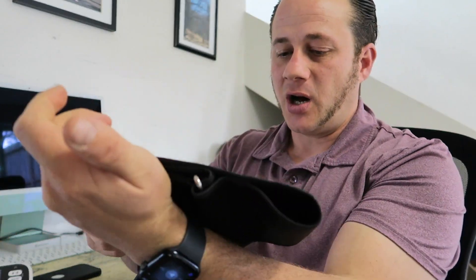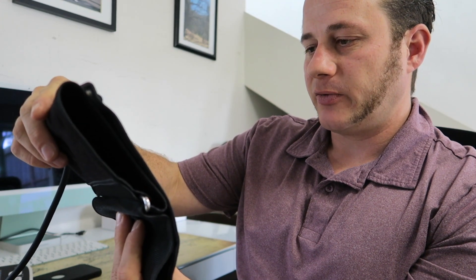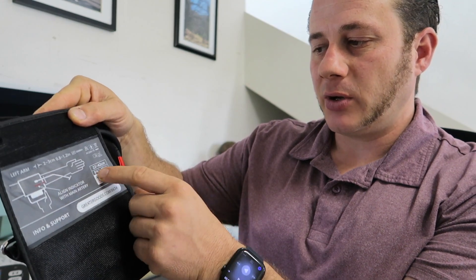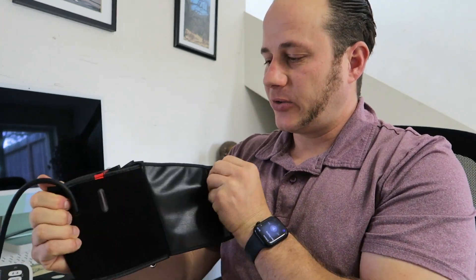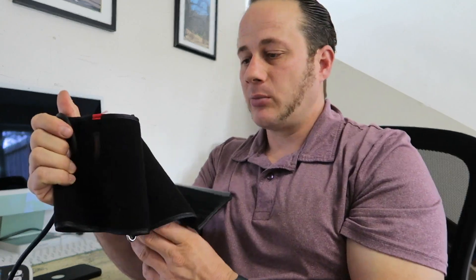It comes with this cuff, which is a large — good for arms up to 16 and a half inches. If you have bigger arms you'll need to get an extra large cuff. Another nice thing is it has this little red marker to show you where to line it up with the artery on your arm, which is super helpful. It has a very good velcro on the cuff.